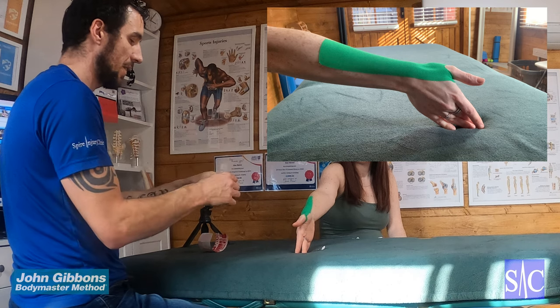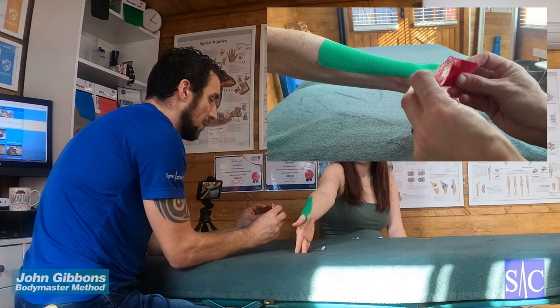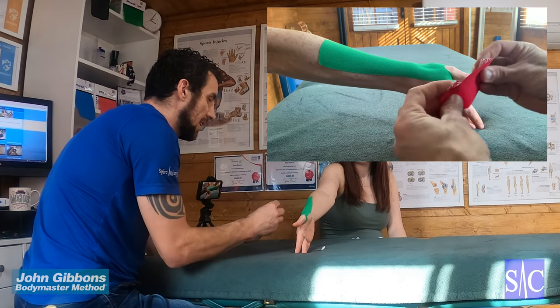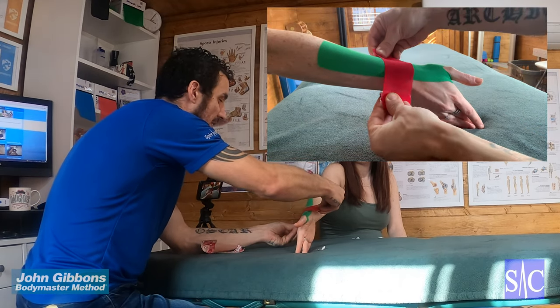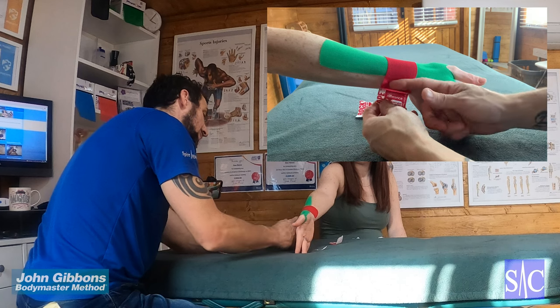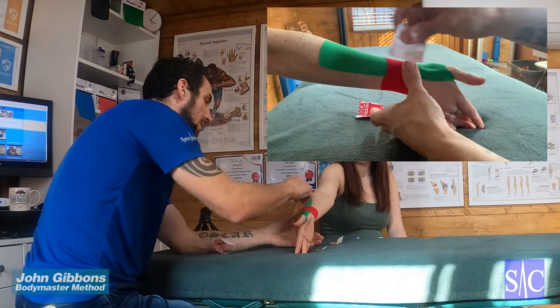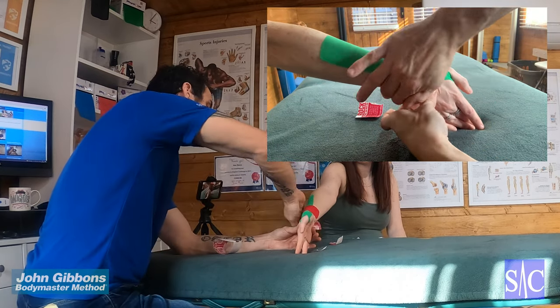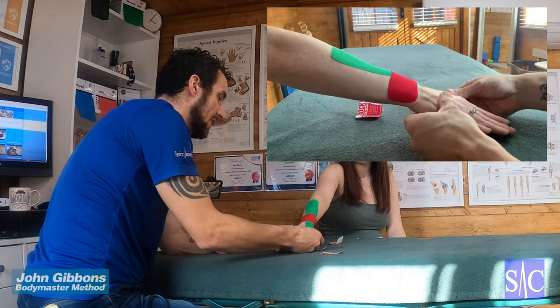Take your second piece, rip it down the middle, pull the sides so the backing comes off, and then at 100% stretch lay it straight over, drop it down, and finish it off with no stretch at all at the ends. Take the printed side of the backing, rub it down to activate the glue, and there you have it.